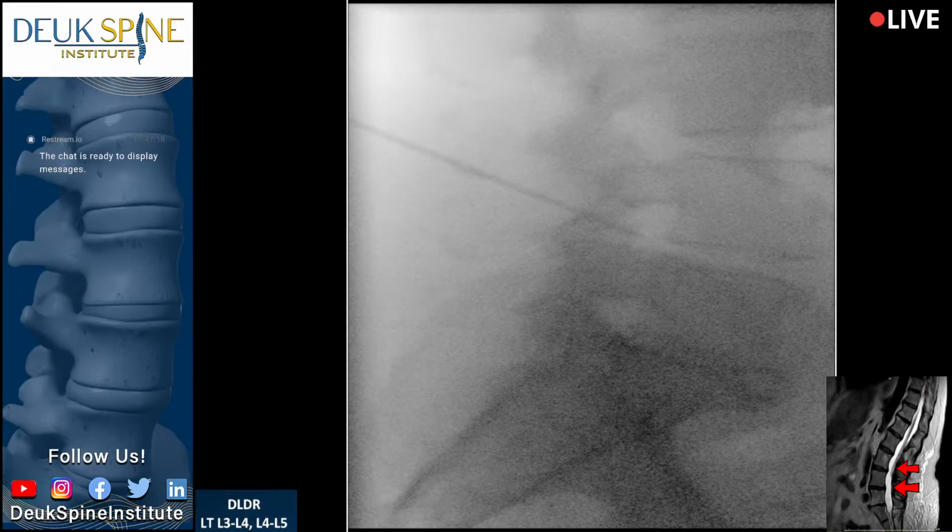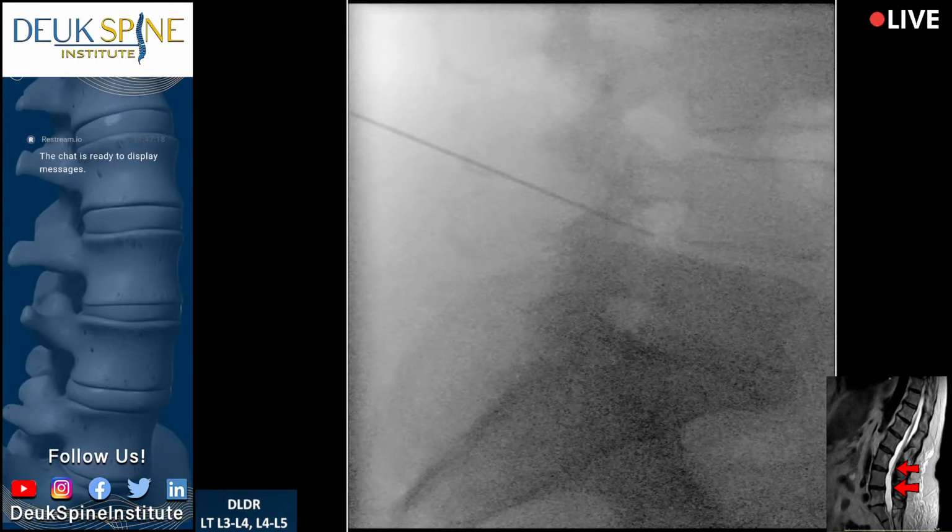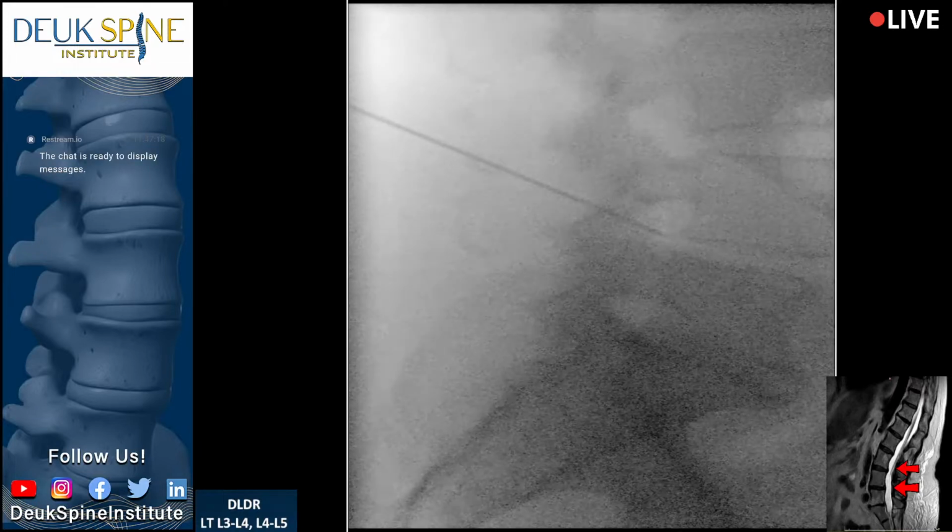Any pain? How is she? Good. Reliable? Yep. All right. Looking good so far. I can feel the herniation. You could see the needle in the foramen right against the herniation. AP? You're doing great. Lay still. She's not moving or anything. I'm very pleased. Are you happy with her?